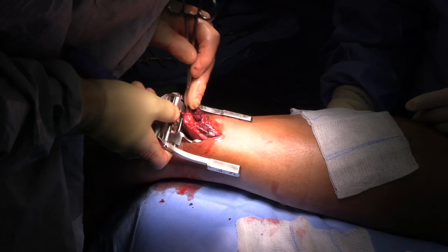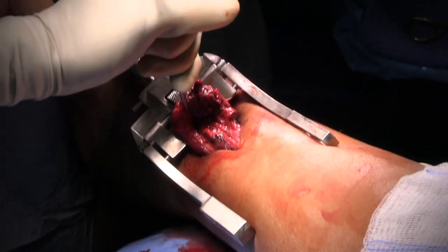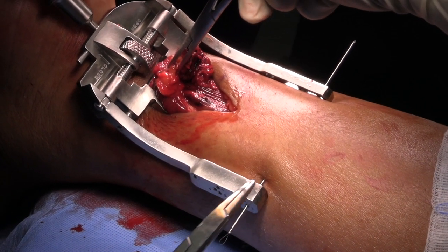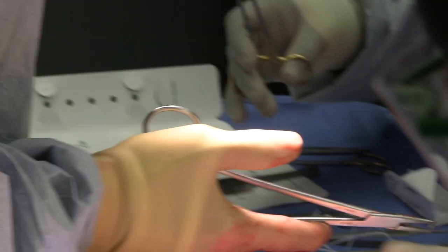The way this works is you see these two little shoe horns that go on the inside. This was pulling down, so we're going to put the first needle in. We're going to leave this one because it's holding the tendon down. So we pulled it down and now we've gone through the skin, through the tendon, and through the skin on this side. It's holding the rest of the tendon down now.